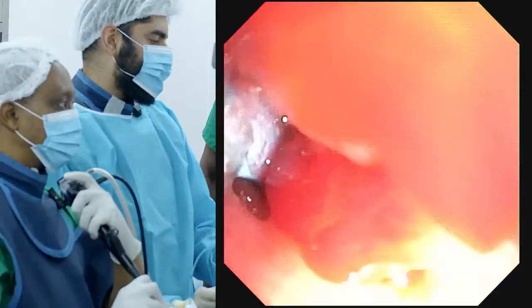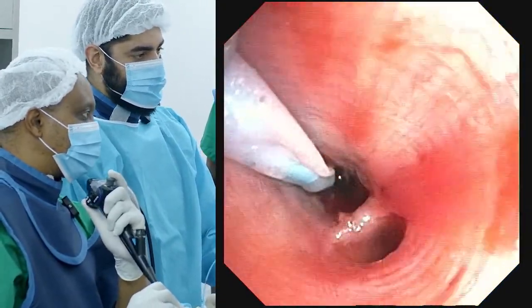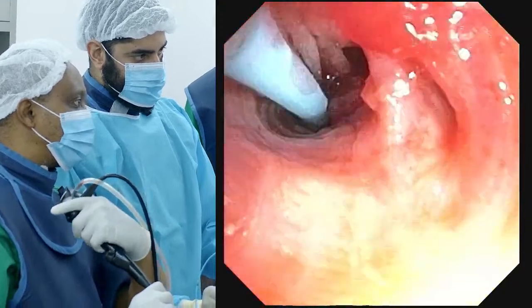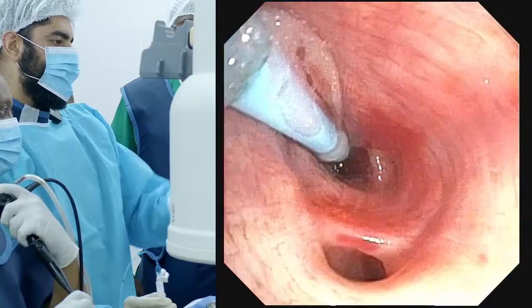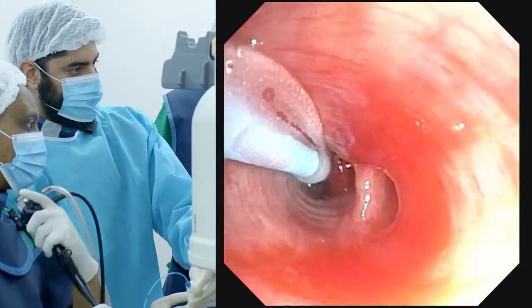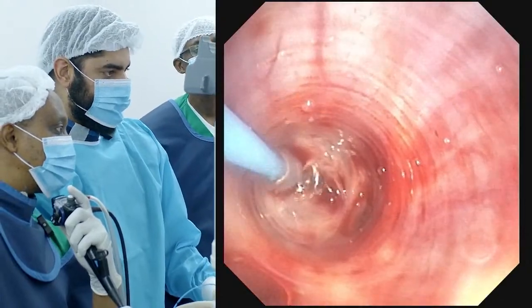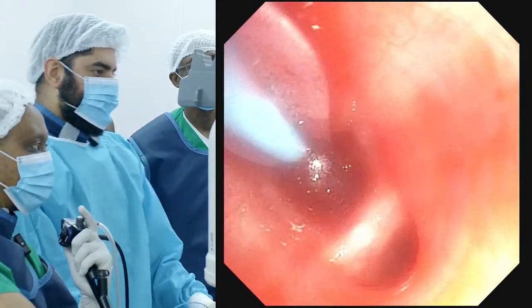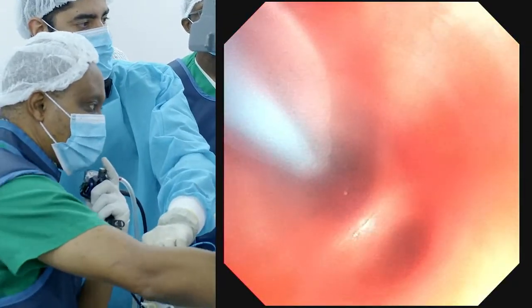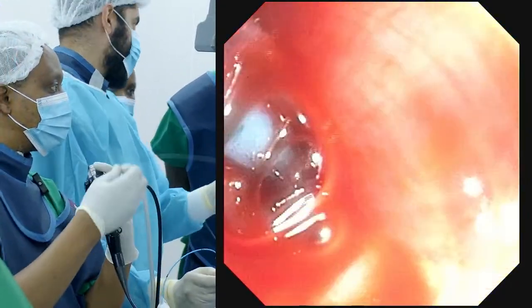Yeah, it helps. We find I've used the one without and with. I like this one, so I'm happy with it. But you see the blocker is right in that bronchus. So if we're in trouble, we can block it off now. And there we go. So this tends to be a bit of an insurance policy. This blocker helps us because it's an insurance policy.